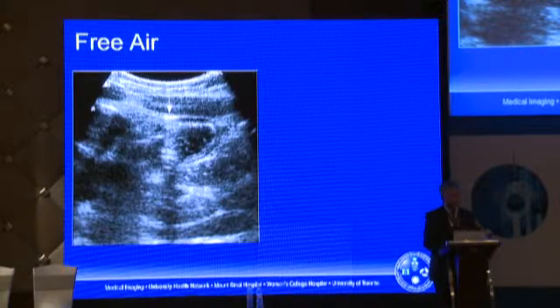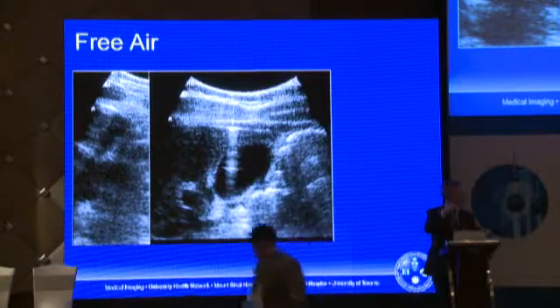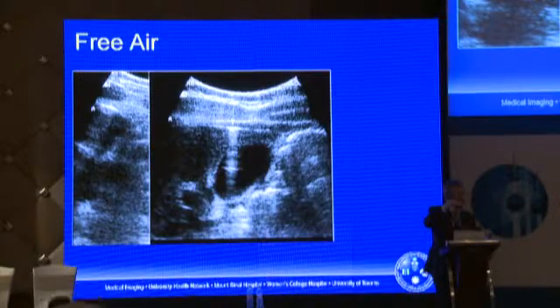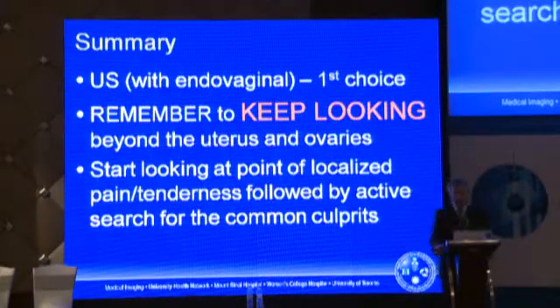This is what it looks like, this focal enhancement of the peritoneal stripe, separate from bowel with reverberation artifact. And then we see it in the right upper quadrant here. A nicer picture would be with a linear probe. So if you want to capture a nice picture for a talk, put on the linear probe, and you will see it. And this is the patient I showed you earlier from today with the linear probe and that focal enhancement and reverberation.